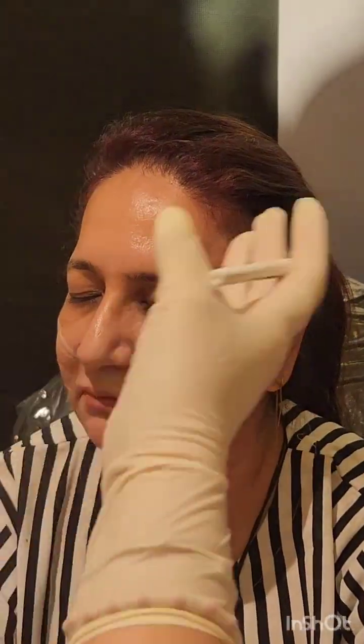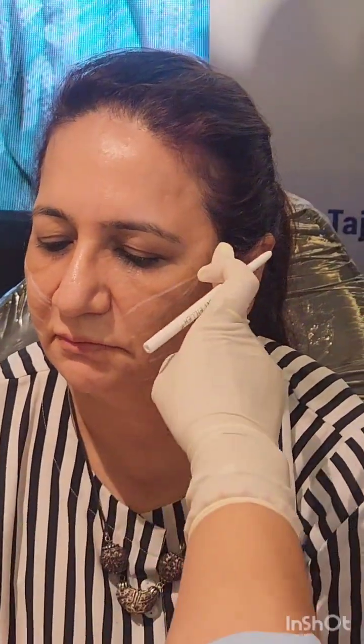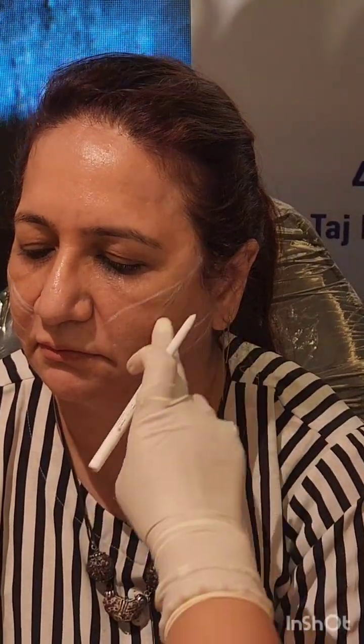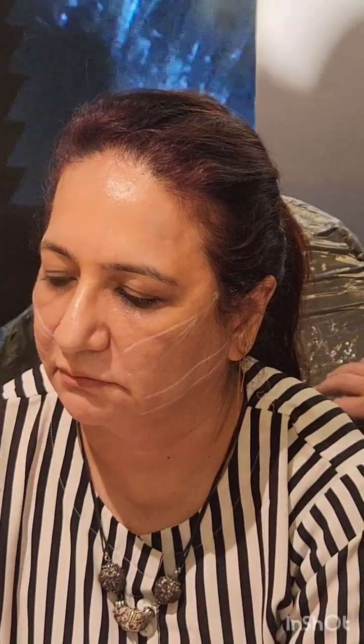So this is a straight vector technique, okay? If you want more threads to be introduced, you can do the cross hatching. You can cross the line, and that will give more lifting and more superior lateral direction.